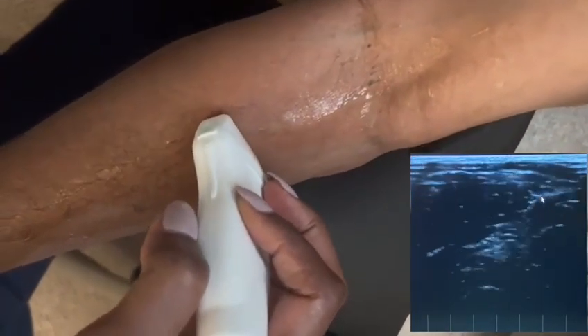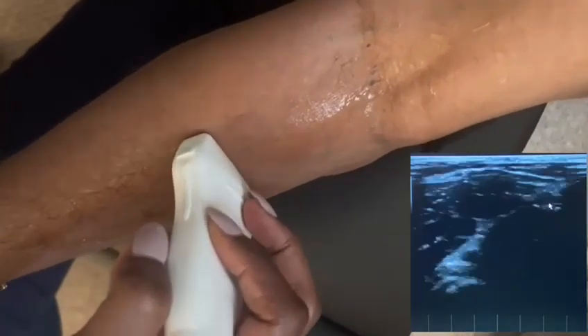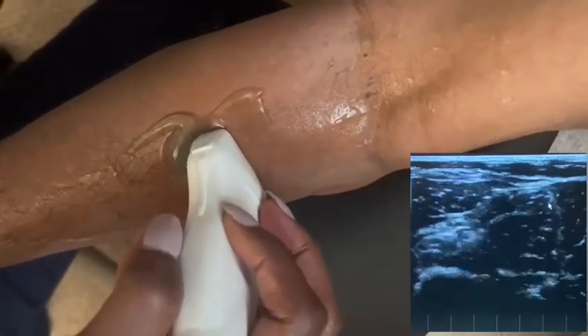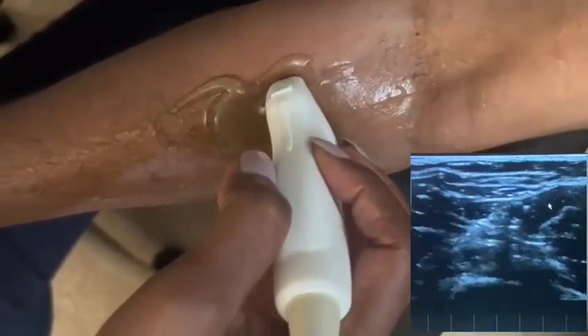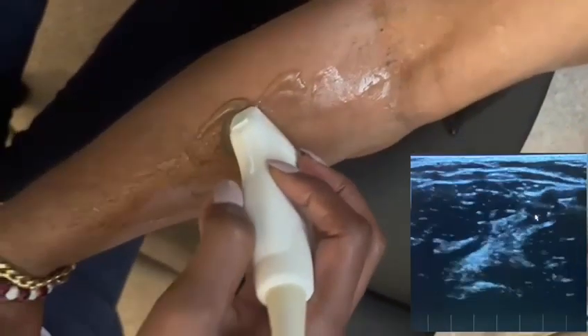Right at this vessel here — that's your radial vein and artery. I'm going to get some more gel and follow that down. Let me go back up to clarify: you can see the split, and you can see your radial vein and artery right there. I'm just following the radial vein down.